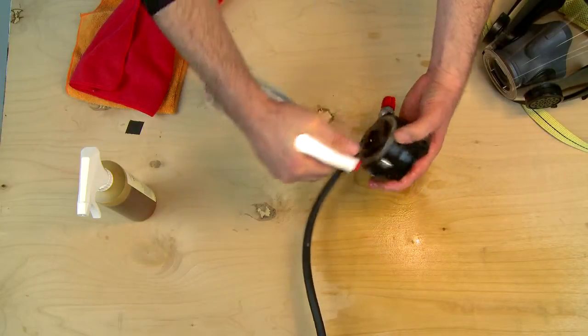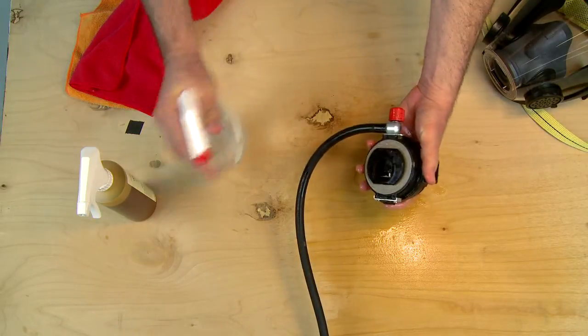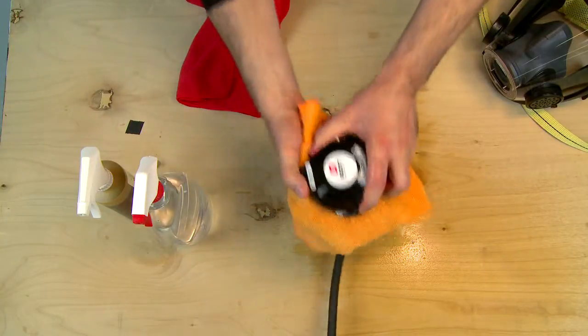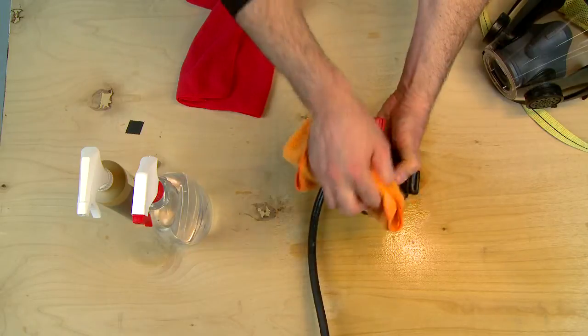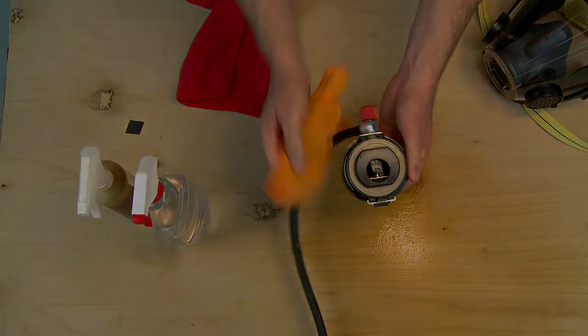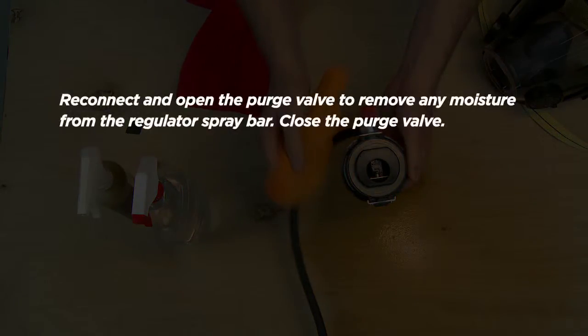Wait 10 minutes. Rinse the regulator with drinking water using a spray bottle or gently running tap water. Shake the excess water out of the regulator. Be sure to completely air dry the regulator before use or storage. If the regulator was disconnected from the air supply for cleaning, reconnect and open the purge valve to remove any moisture from the regulator spray bar, then close the purge valve.